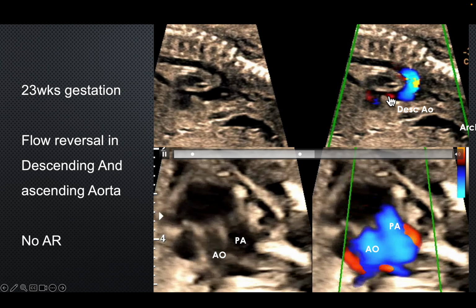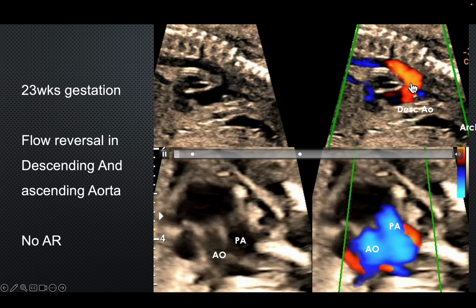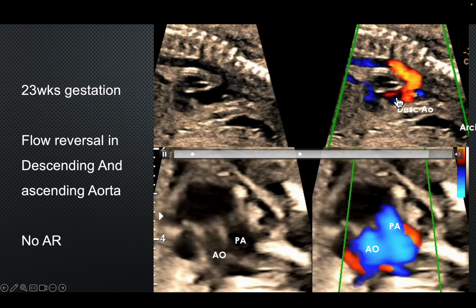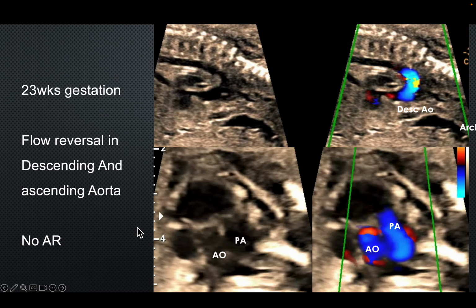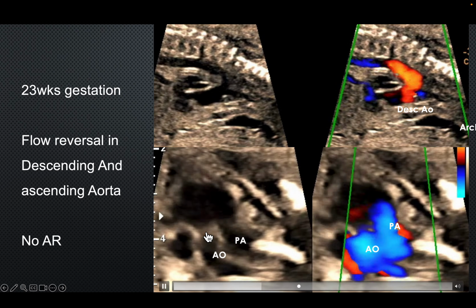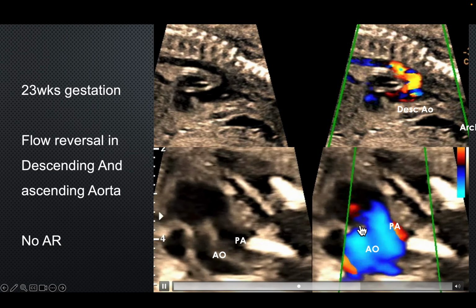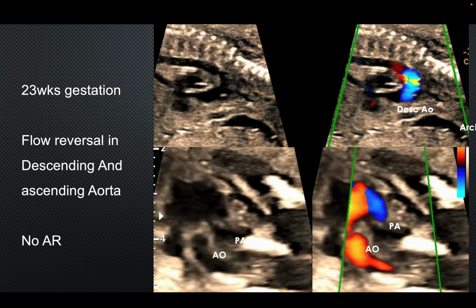And once you see there is a to and fro flow in the arch of aorta, which actually indicates that there is some runoff in the ascending aorta. The commonest reason of runoff here, you could always think, would be aortic regurgitation. So when you see here, you see the pulmonary artery, and that's the aorta, and this is the aortic valve. There is a to and fro blood flow in the aorta up to the aortic valve, and no regurgitation into the ventricle. So what's happening?